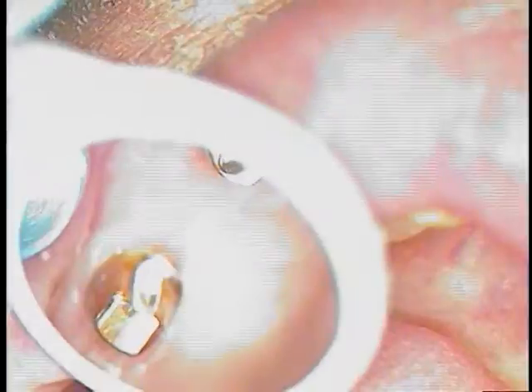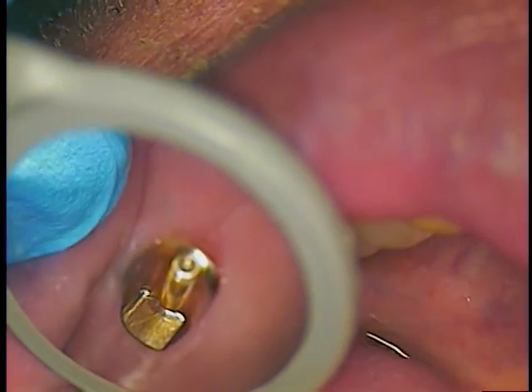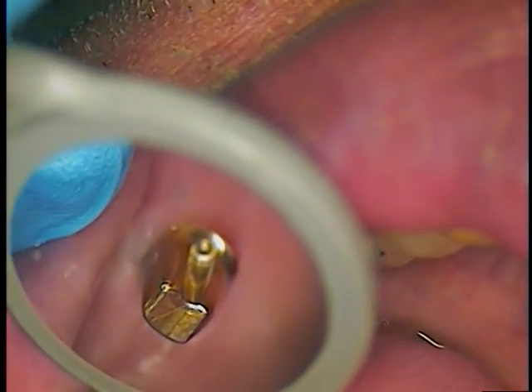Or anodized, I would say — gold anodized. The tissue just likes that; it's nicer for the tissue. It's also nicer if you have any aesthetic issues, so you don't have a darker situation coming through.